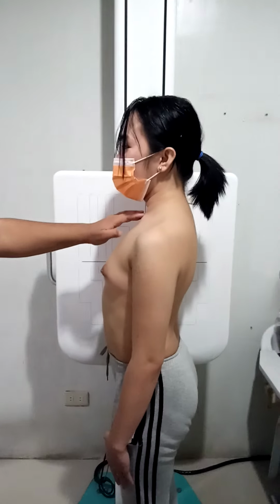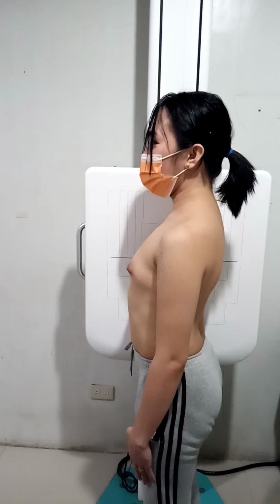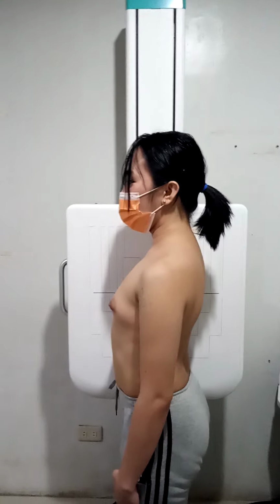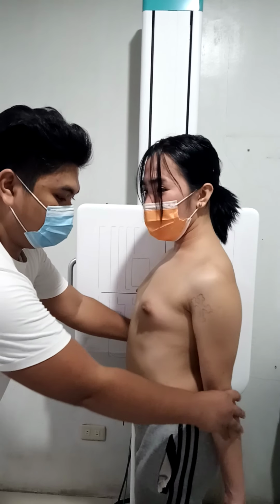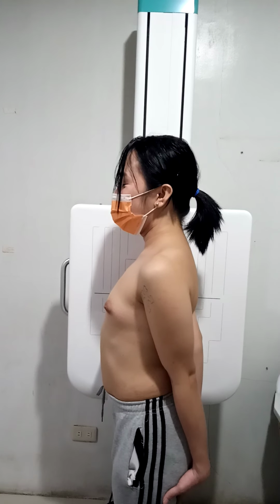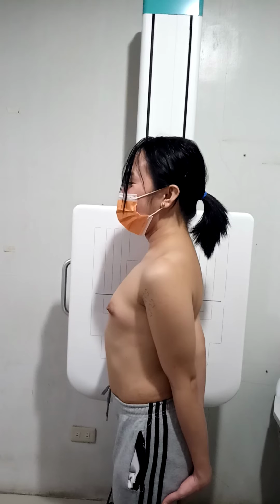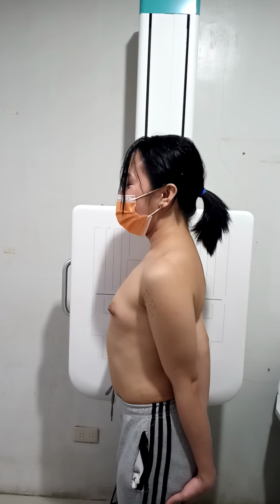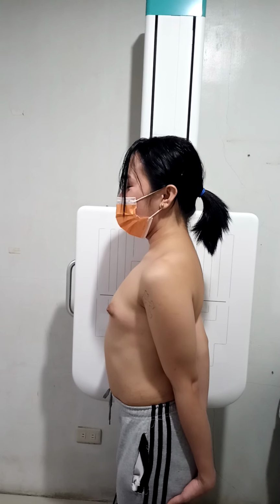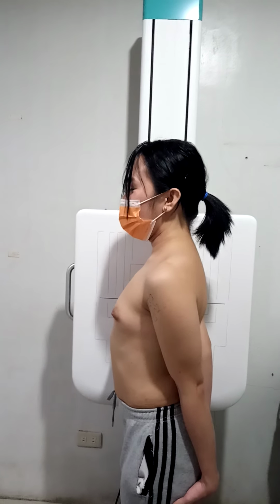So this is the jugular notch. Have the patient rotate the shoulders and arms posteriorly for upright positioning. So posteriorly, put your hands at the back. Then center the sternum to the grid and adjust to the true lateral position. Then always remember to shield the gonads of your patient because they are very sensitive.